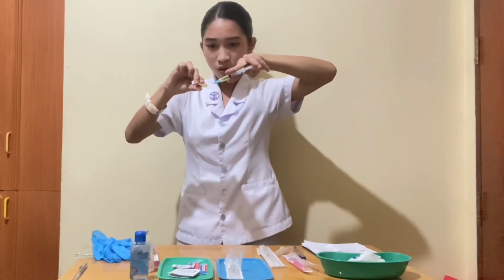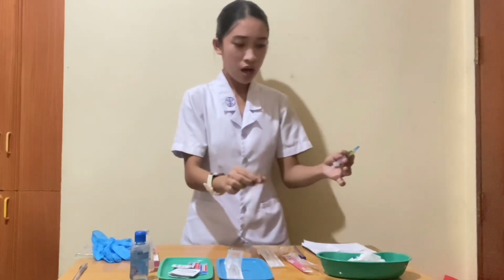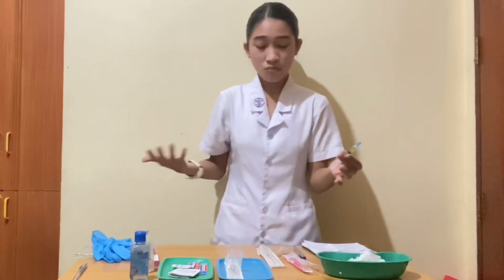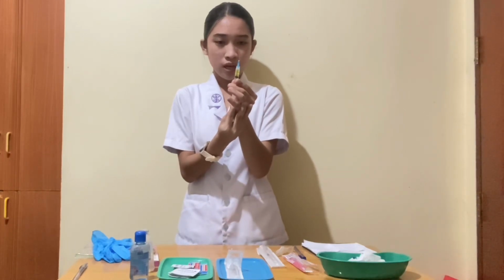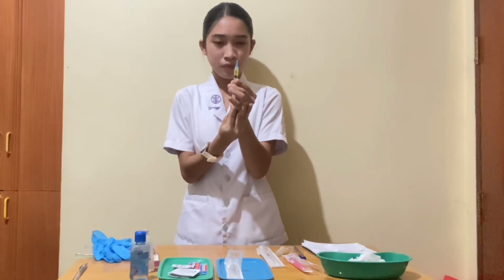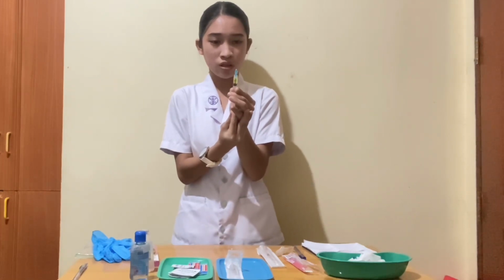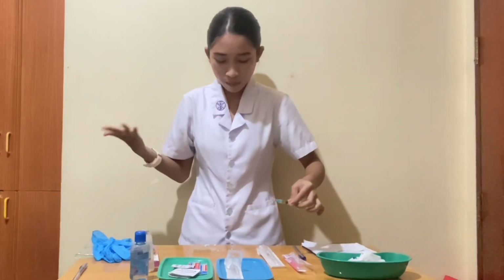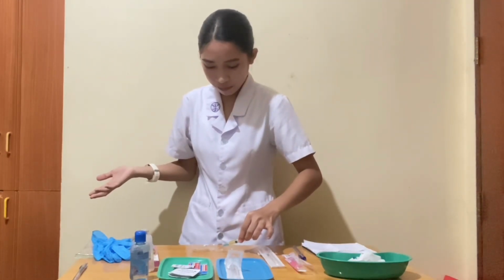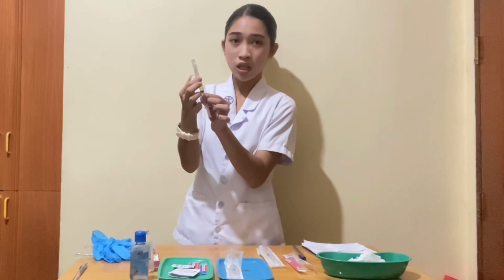Now I'm going to dispose of the ampule, and then I'm going to remove all the bubbles from the medication, to avoid any bubbles getting into our patient. So I'm going to recap this one, doing it like this to avoid pricking our finger, and lock it.